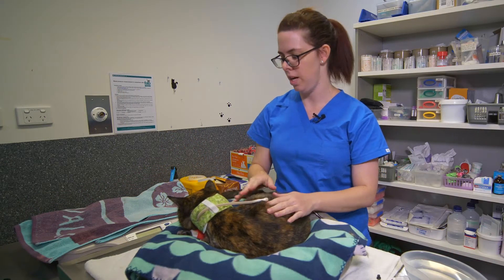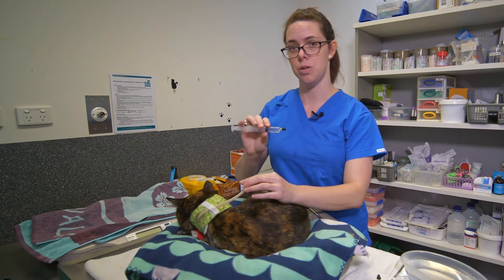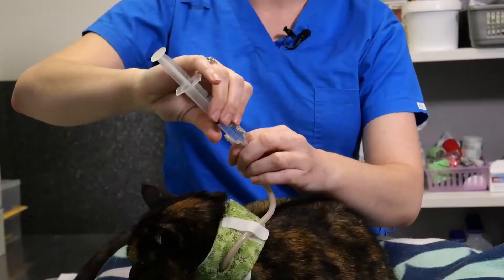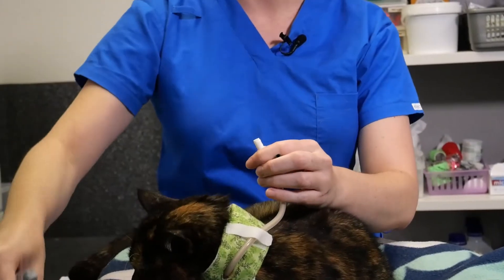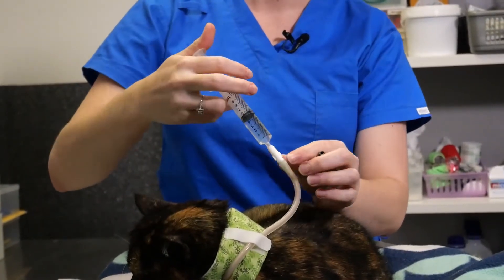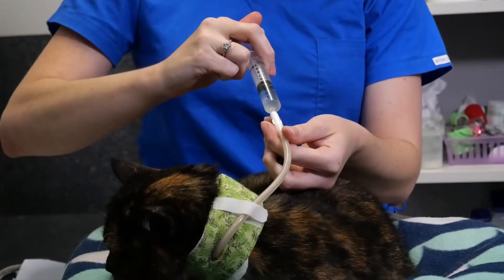We've just finished giving Missy her tube feed. Now we're going to flush with water again to clean out the O tube of any excess food and clear the tube. Undo the cap, put in about five mils of water, and slowly administer that over a minute or so.